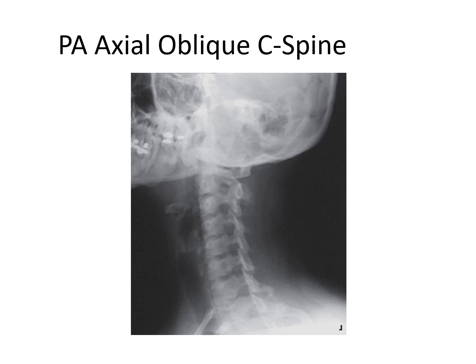And this one's nicer. If you compare the two, going back and forth, you might notice the intervertebral foramen are actually magnified on the AP axial projection. On the PA axial they present as more normal in size, non-magnified. And there's good reason for that. We've reduced the OID by about 4 inches.